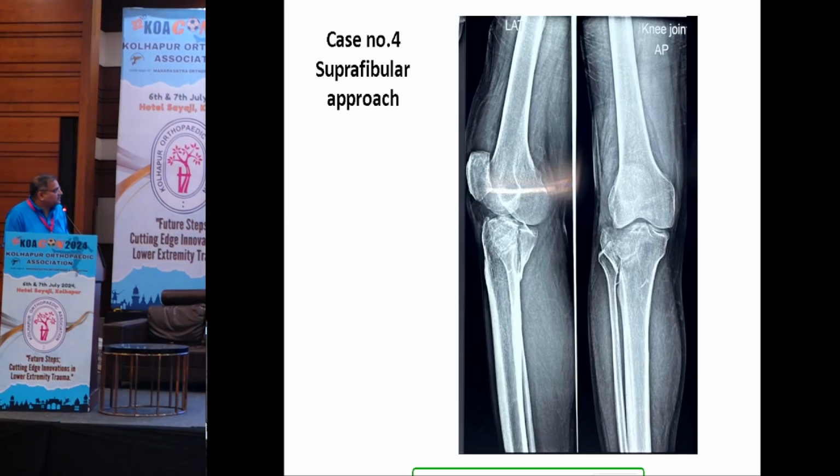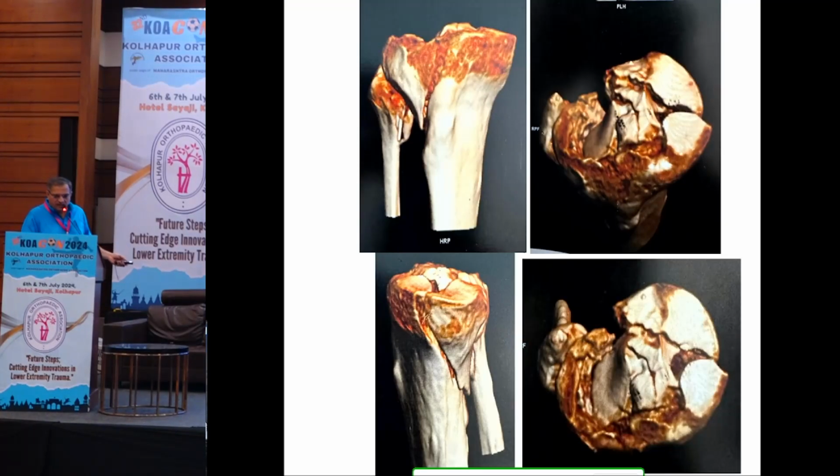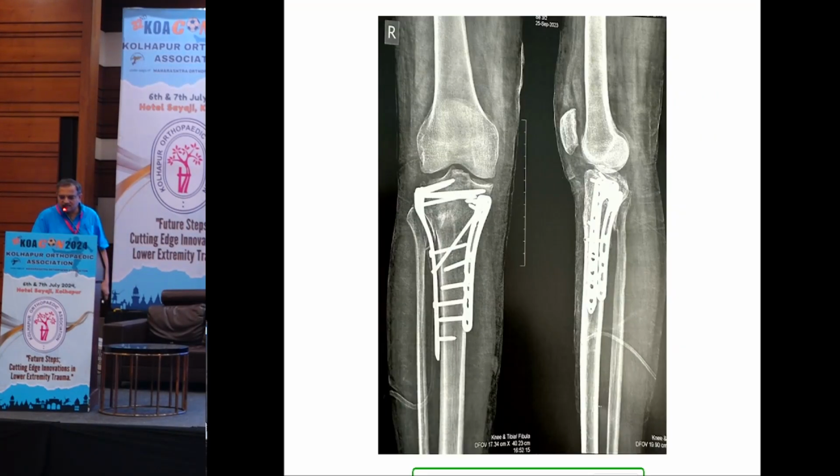That is his function. Now again, this is a similar case wherein you can notice that the depression is too much, and a suprafibular approach is a wonderful approach. This also is a video. I will go, and then they will show us the video. So that is the outcome.